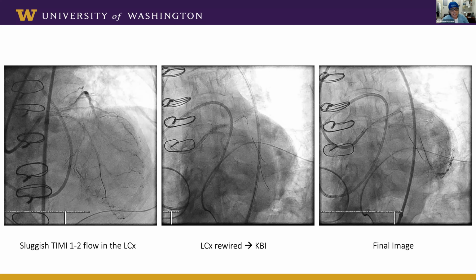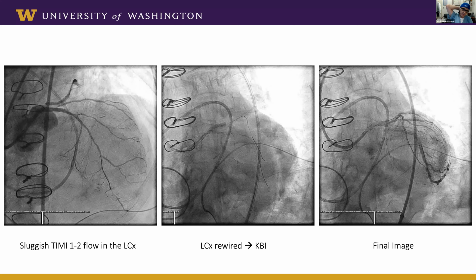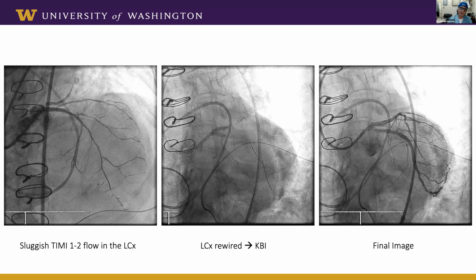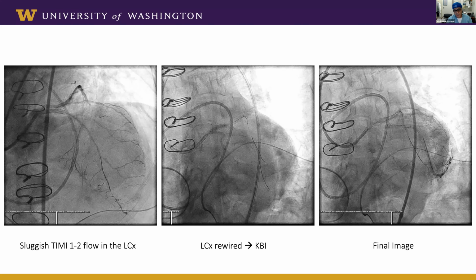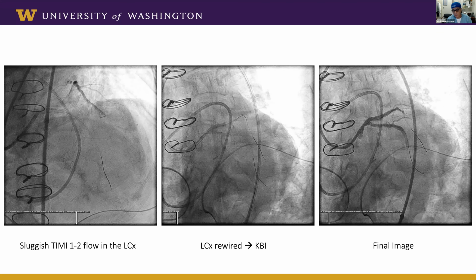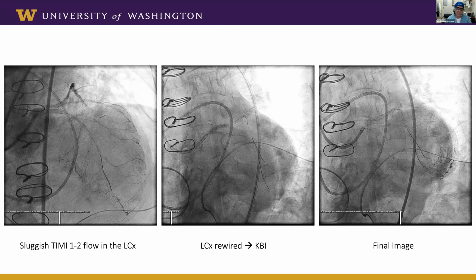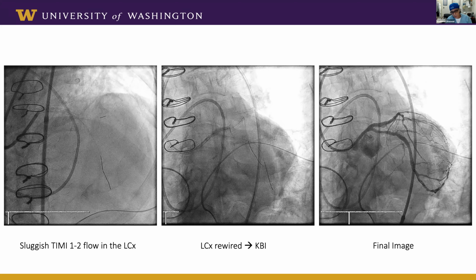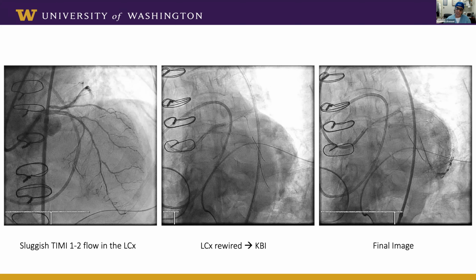Yeah, absolutely. But the IVUS will tell you, right? If you have a wire and you have either a carina shift or a plaque shift that caused it, then if you balloon it and you IVUS and that's all you have, I think you're good. But if you have a flow-limiting dissection that you ballooned, you could actually tack it. But this is from the old days of angioplasty, right?